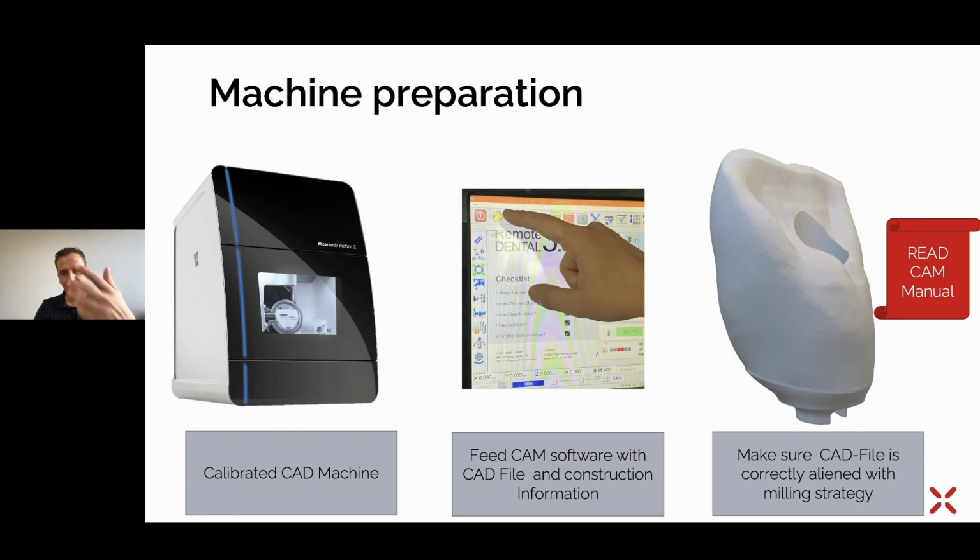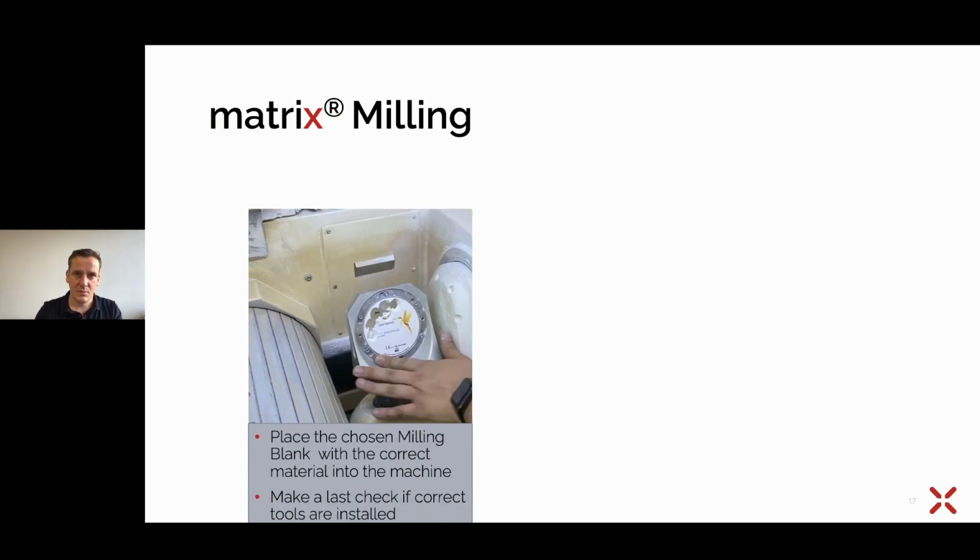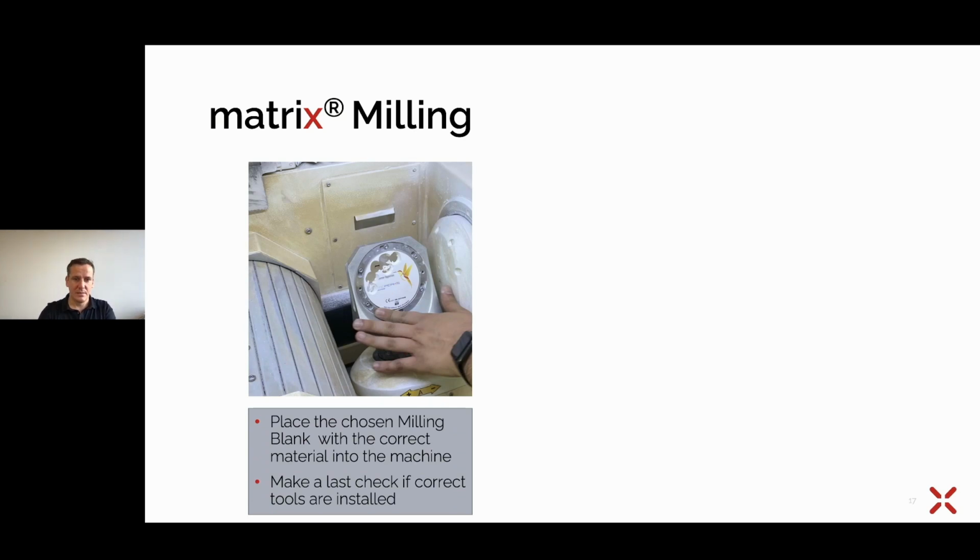All this you can read in the CAM manuals, which you will get later on in the download area, and which will also be explained by my colleague Rafael Perez later on. He explains exactly how the manuals work, how to install, and how we do that with the milling strategies in these software.